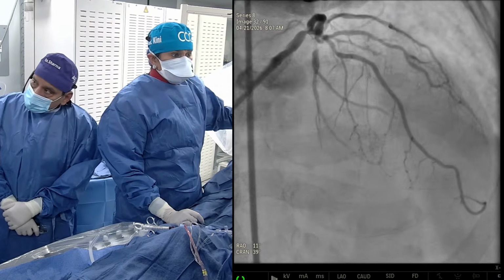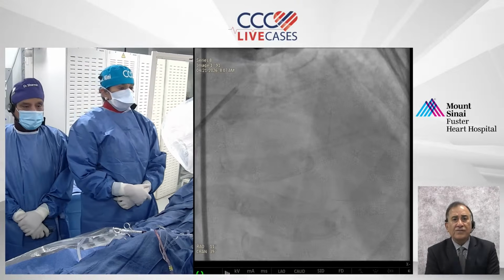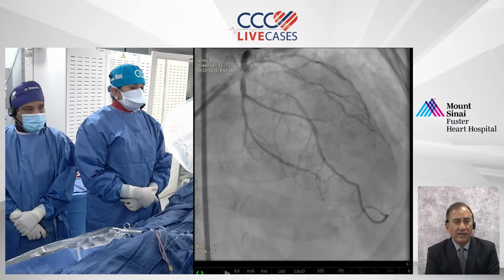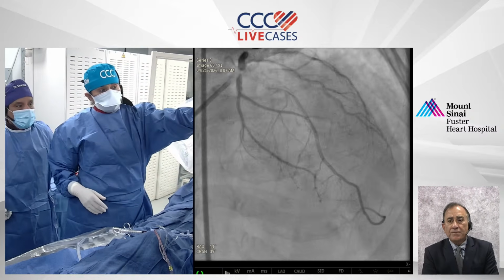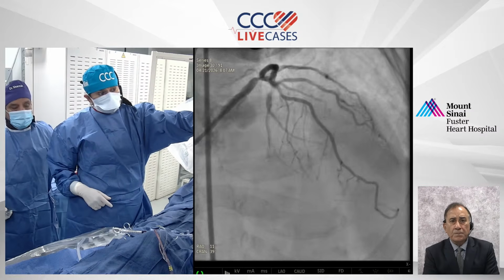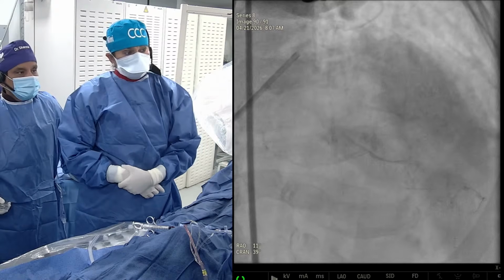Active audience questions are already shooting up. Anu, I think you'll find it intriguing too. First of all, the observation is why no Impella? That probably is because of the good EF. We'll talk on that a little bit. In the cranial view, you have D1, D2, not diseased, but most of the disease is in the calcific LAD.